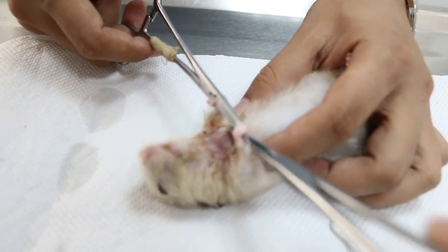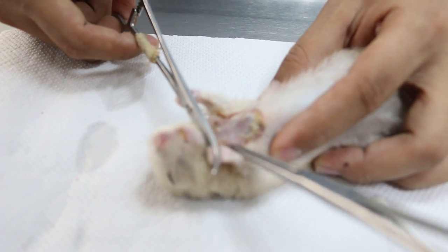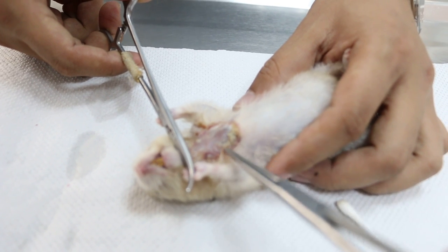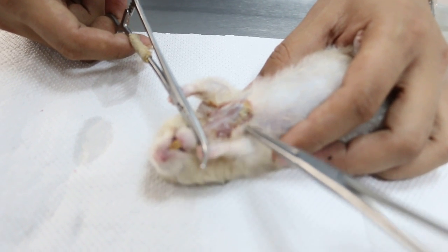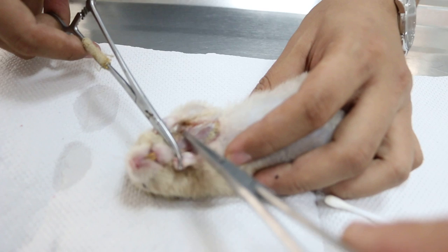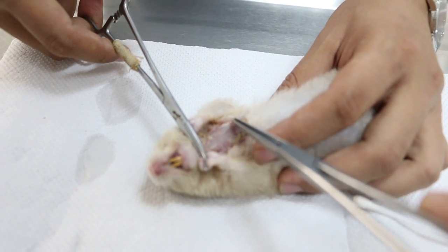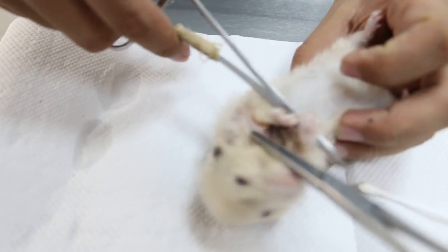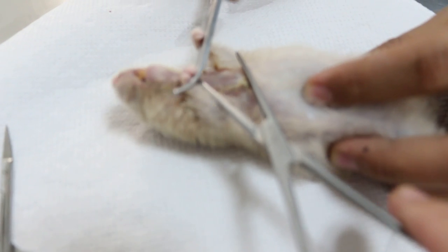It's not possible to stitch up from here to here, and that's why the stitch broke down. There's infection and smell. Now as you can see the wound — one option is to open here, but there's no space. You could open here, open here, and then put back the skin, but it's difficult to close by stitching after removal of the tumour. It's not possible because of the big tumour.